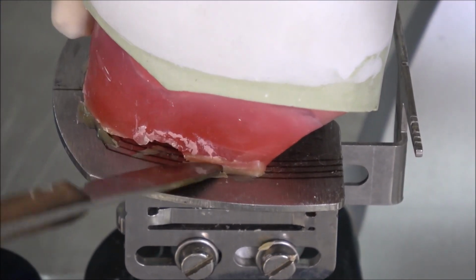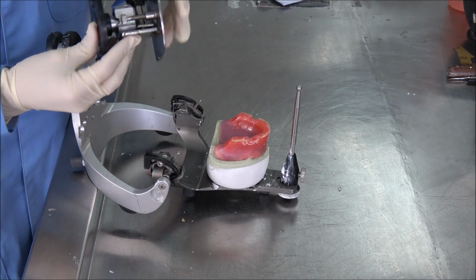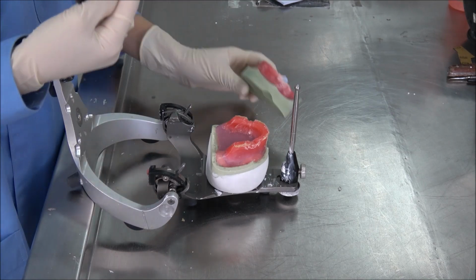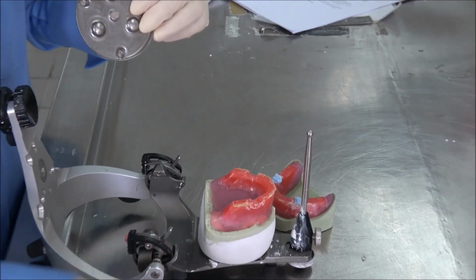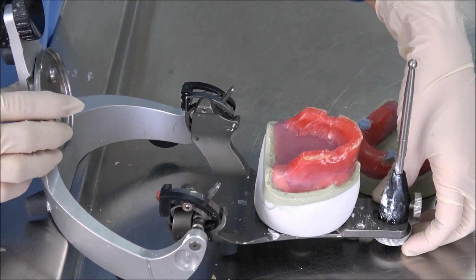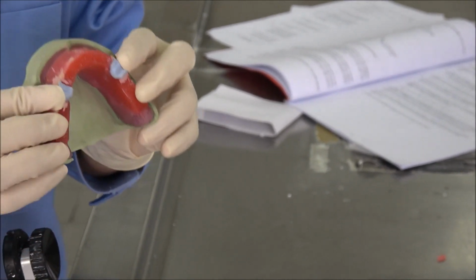We use our wax knife to take it out, and we turn our articulator upside down. We remove our occlusal table. Before we fix our model, we have to put our mounting plate here. Make sure the arrow, as I told you before, is facing our incisor rod. We have to follow our notch here and put back in the same notch to lock it.